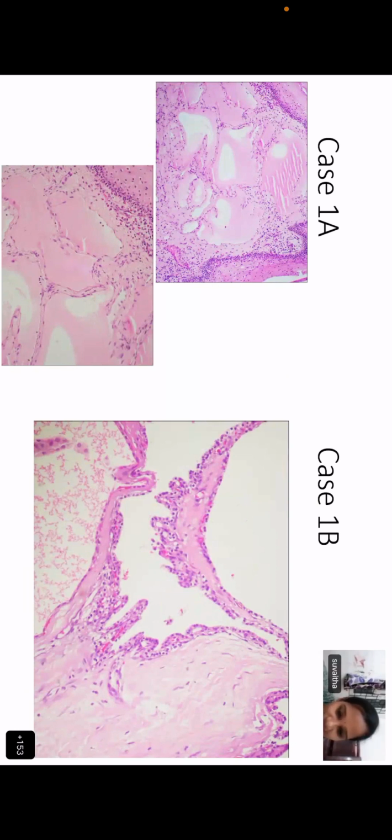I thought it was a continuous lining, and the cells have the nucleus appears flattened. Yes. So you said two things. You said the nucleus appears flattened, and you said that it is a continuous lining. So what does that make it, an epithelium? These two features that you saw, they are going to ask you, and I'm asking on their behalf, why do those two features make it an epithelium? I'm not sure, ma'am.